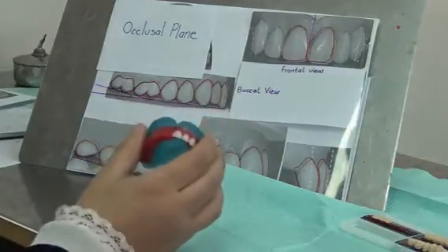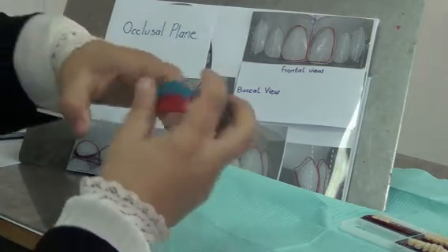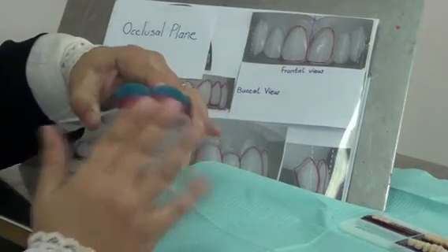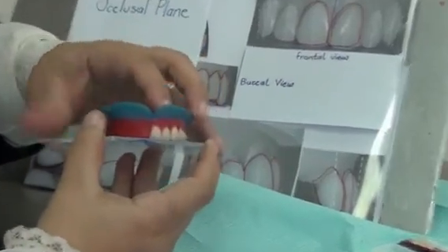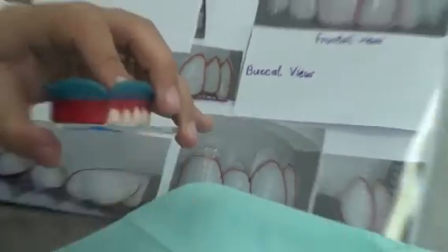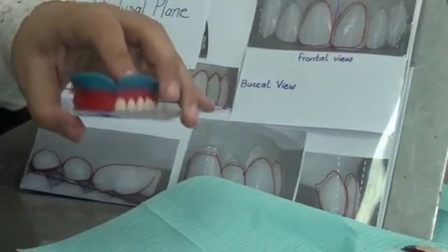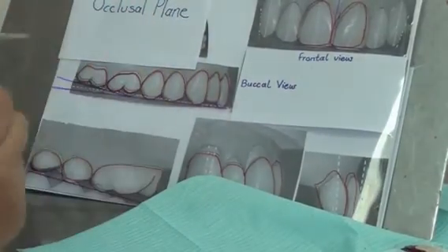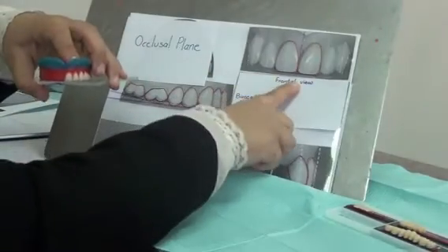If I take the cast or the base plate outside the articulator and put it on my glass slab, what represents the occlusal plane now is this glass slab. Okay, but whatever I am doing here, once I finalize the teeth position on this occlusal plane, I go and check it back on the articulator. So what are we looking for in comparison with the occlusal plane? First of all, I have to look in front. This is the frontal view of the teeth.